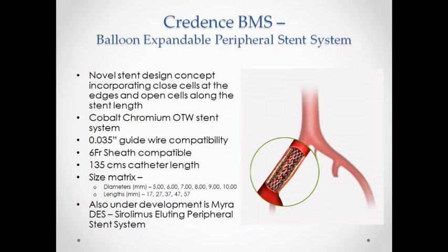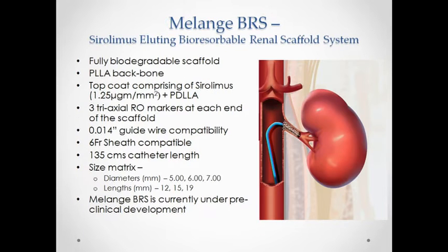You can see that we are having a tight narrowing there. How long do you plan to keep this inflated? I think we are keeping it in seconds here. She's tolerating it, though I don't think we should keep it too long, because she will definitely have hypoperfusion.